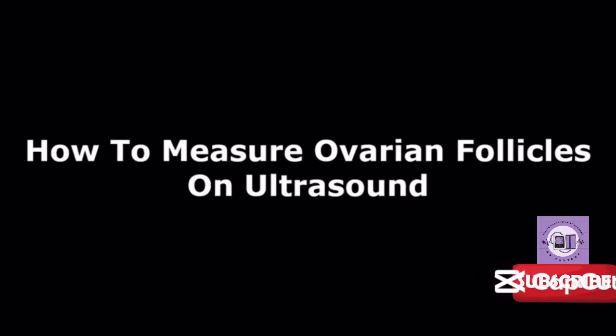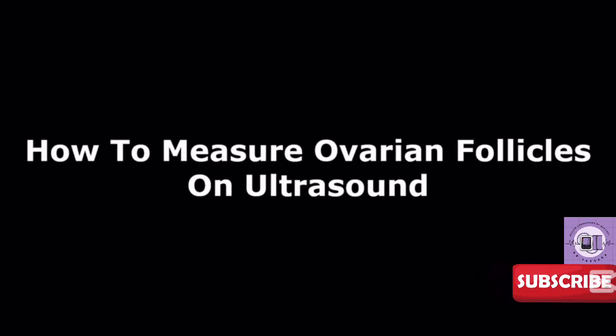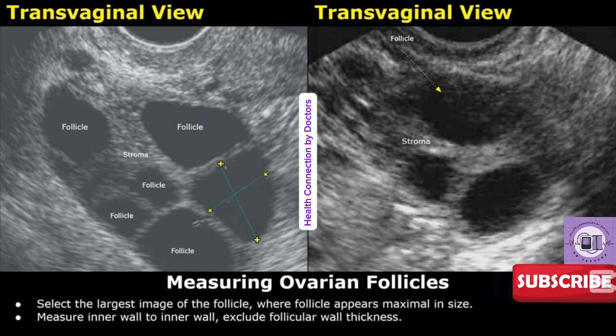Hello everyone, it's Dr. Tayyaba and today we will learn how to measure the ovarian follicles on ultrasound. We will measure an individual ovarian follicle using the standard two-dimensional transvaginal ultrasound technique.